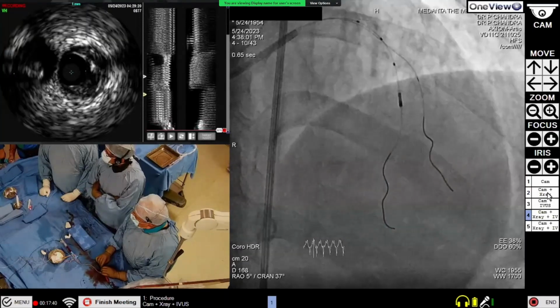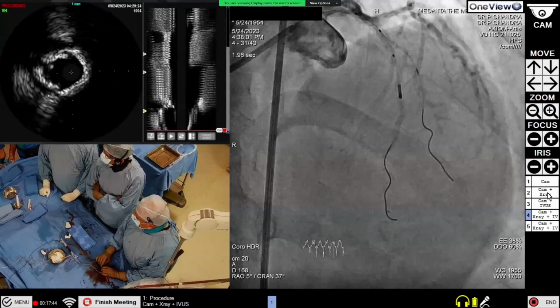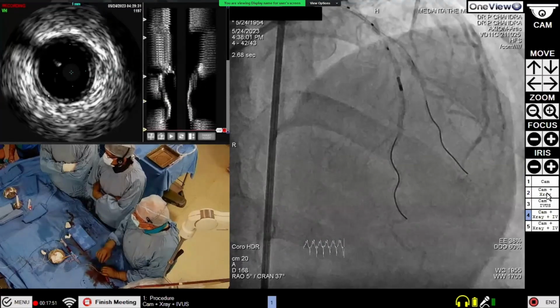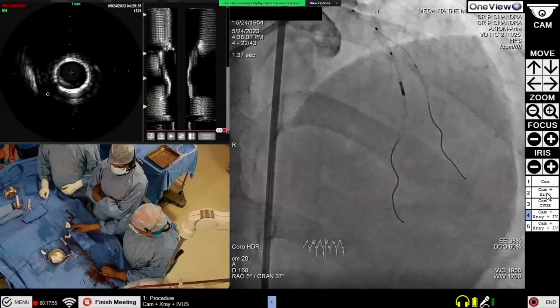Quite big. Here we see a calcified lesion, and here it is 360-degree calcium. You see, quite dense calcification, just like a ring. And then the LAD is looking quite nice, 4 mm. So this is very interesting.